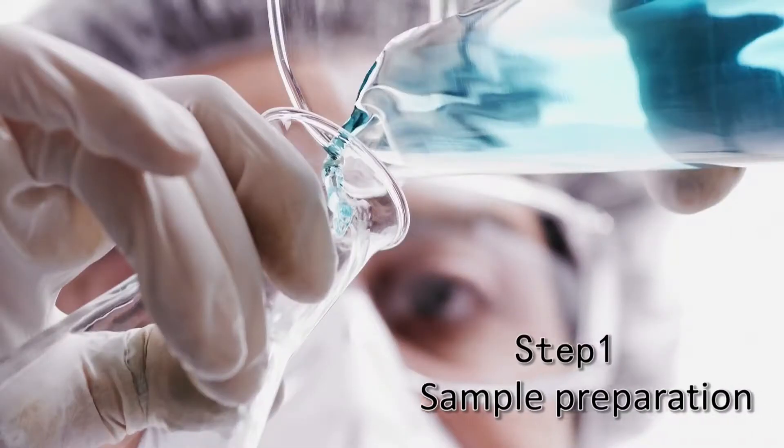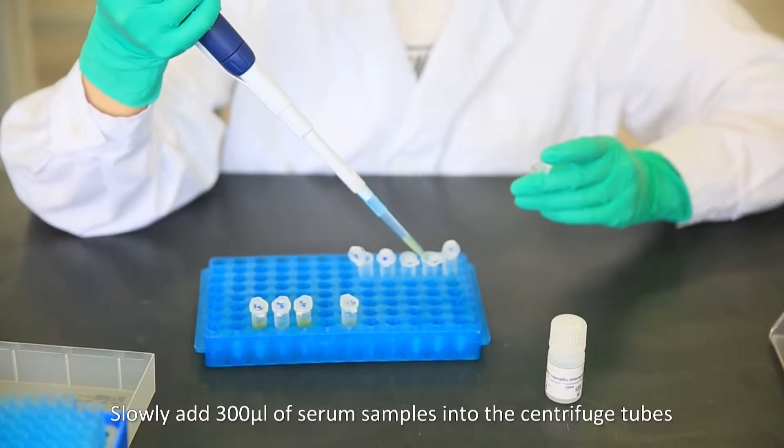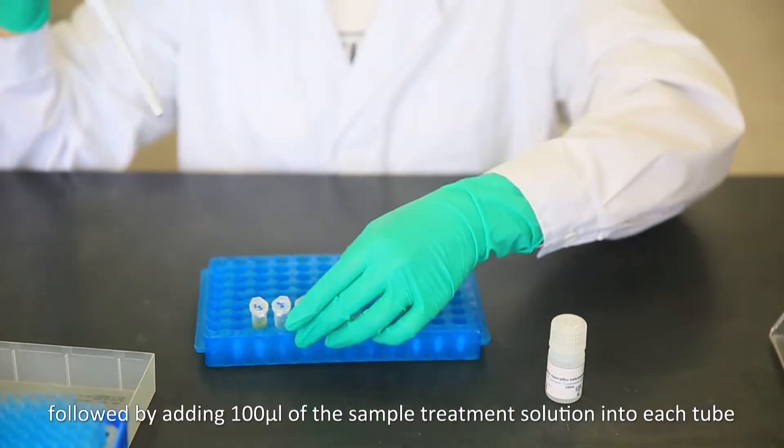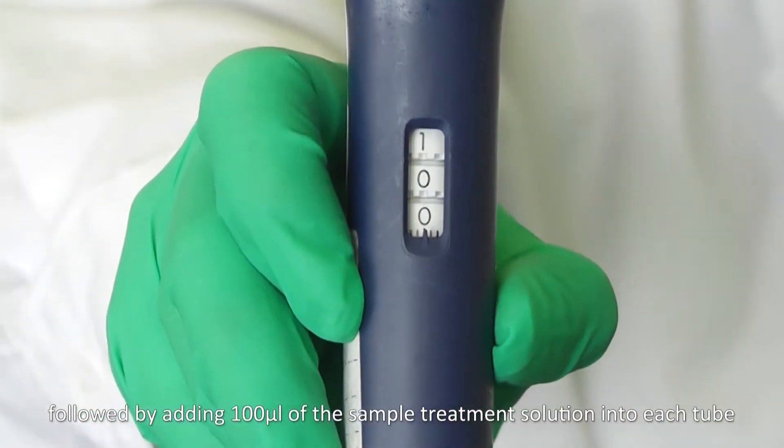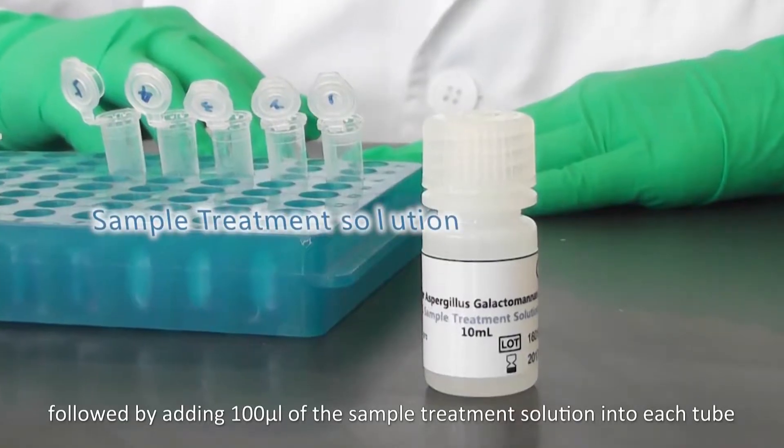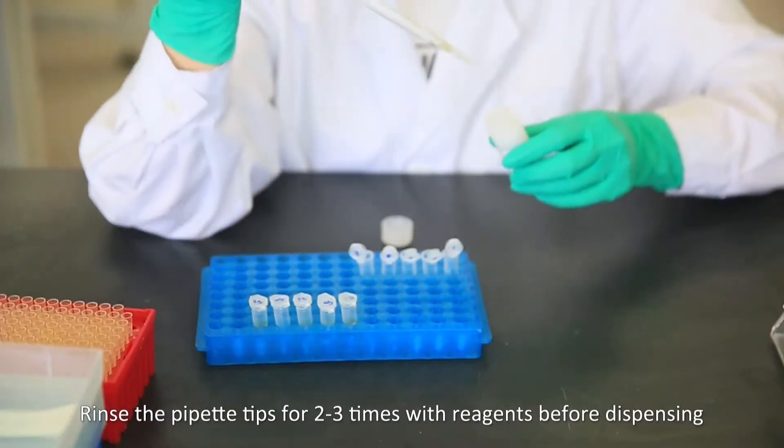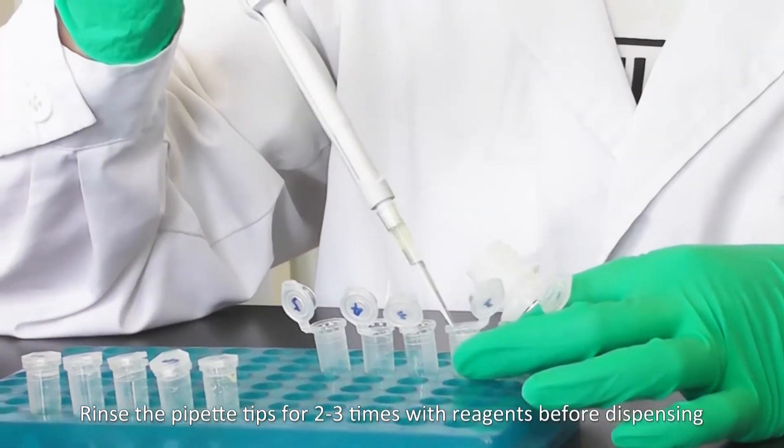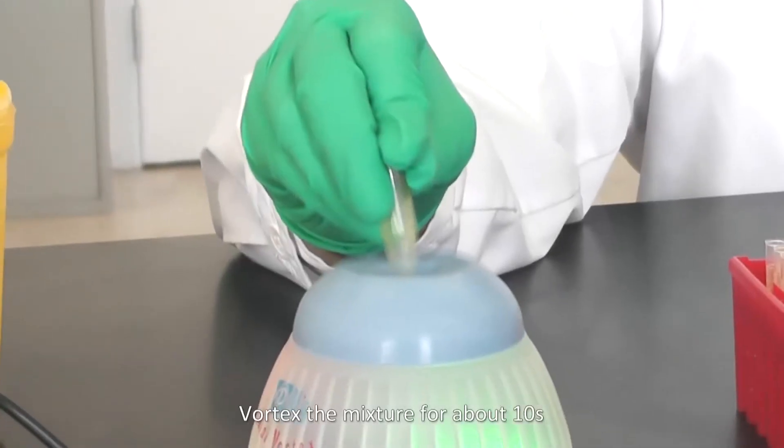Sample preparation: Slowly add 300 microliters of serum samples into the centrifuge tubes, followed by adding 100 microliters of the sample treatment solution into each tube. Rinse the pipette tips for 2-3 times with reagents before dispensing. Vortex the mixture for about 10 seconds.